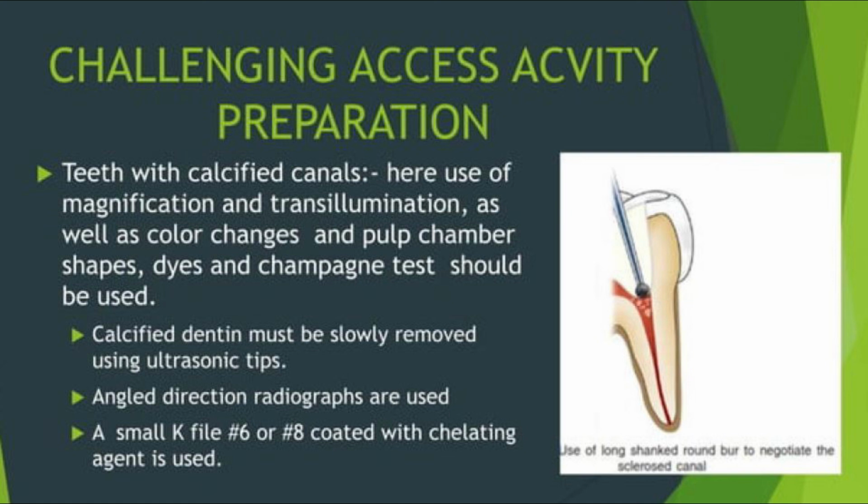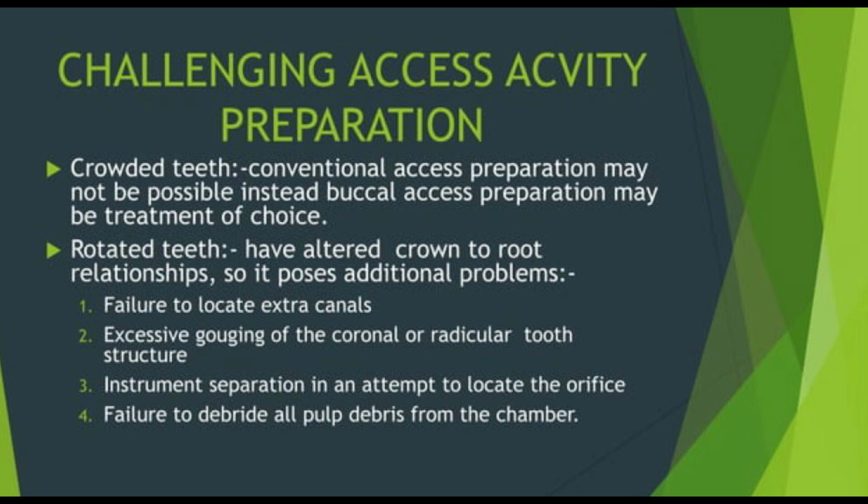In the case of crowded teeth, a conventional access cavity may not be possible. Instead, a buccal access preparation may be the treatment of choice. So in crowded teeth, instead of the conventional access preparation, we may use a buccal access preparation.